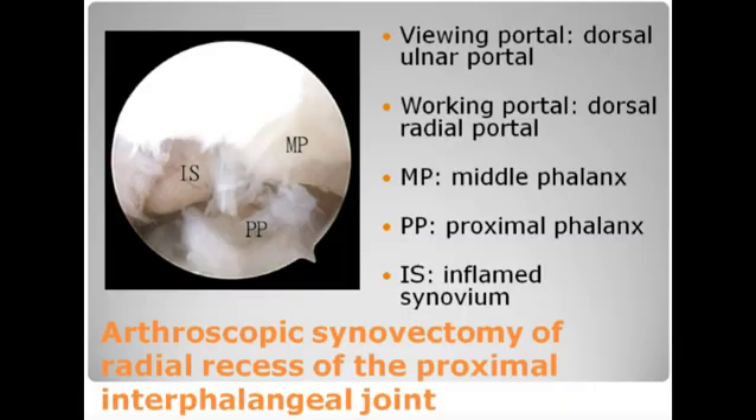The next step is synovectomy of the radial recess of the joint. This is performed with the dorsal ulnar portal as the viewing portal and the dorsal radial portal as the working portal.